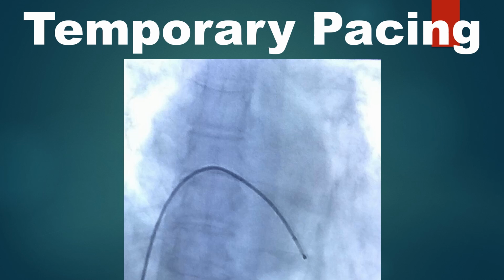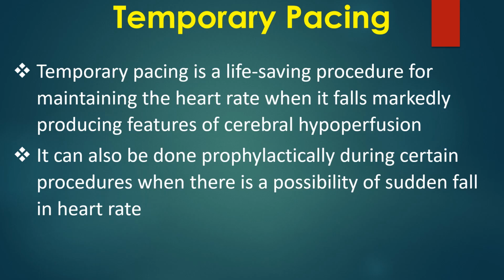Discussion on temporary cardiac pacing. Temporary pacing is a life-saving procedure for maintaining the heart rate when it falls markedly, producing features of cerebral hypoperfusion. It can also be done prophylactically during certain procedures when there is a possibility of sudden fall in heart rate.